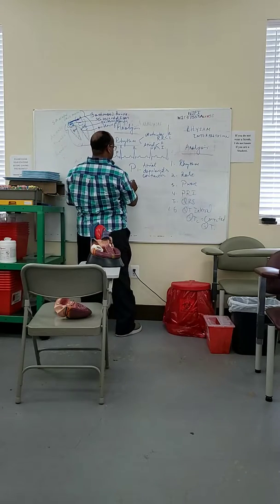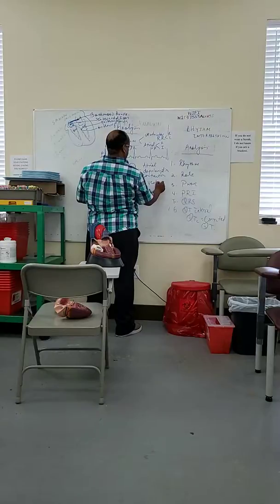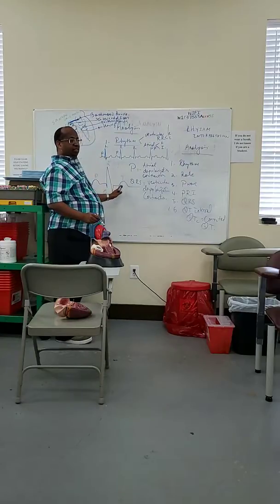So QRS is what? Ventricular depolarization, or that is contraction. Then T wave is the opposite.